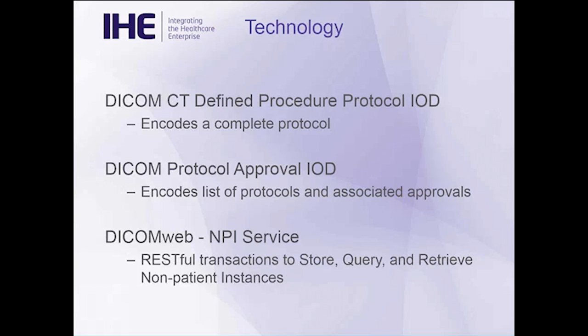One of the services is the NPI service for non-patient instances. Since protocols as defined are not inherent to a given patient, they're stored outside of the patient study series hierarchy. And there are transactions then to store, query, and retrieve those.